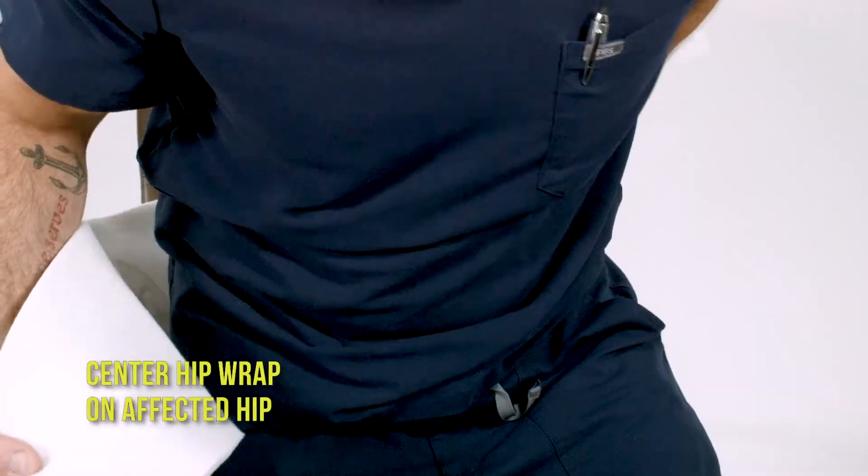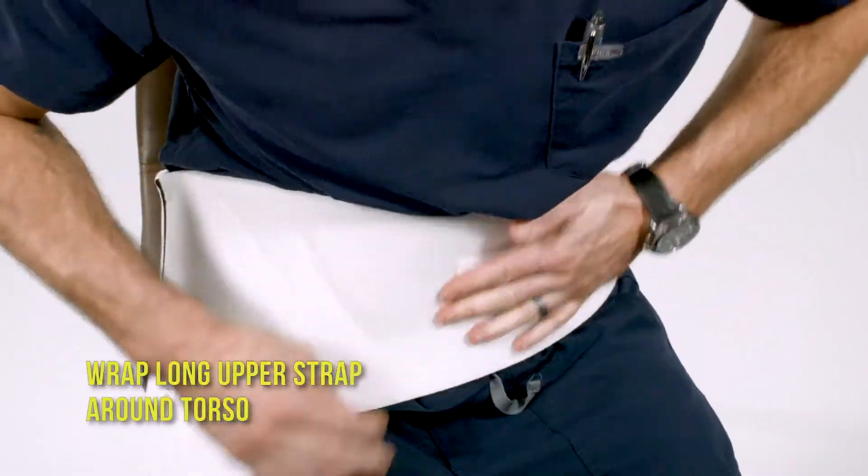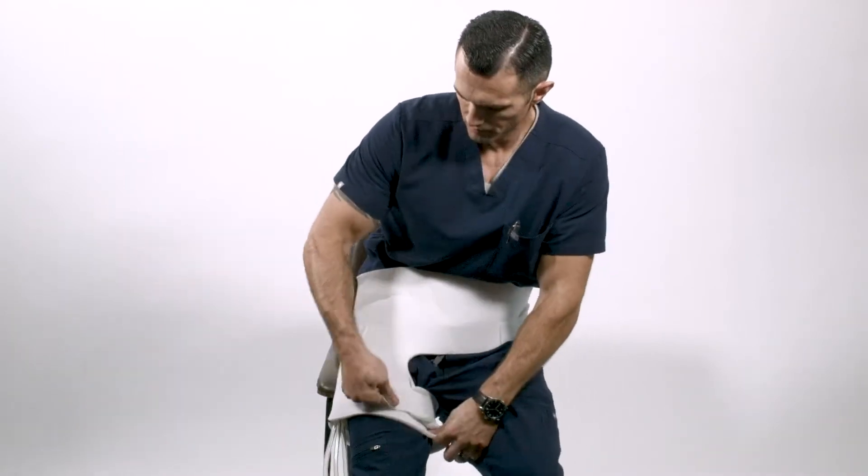Center the hip wrap on the affected hip. Wrap the long upper strap around your torso. Wrap the short strap around the thigh and secure.